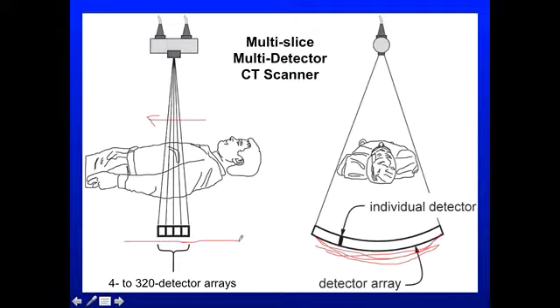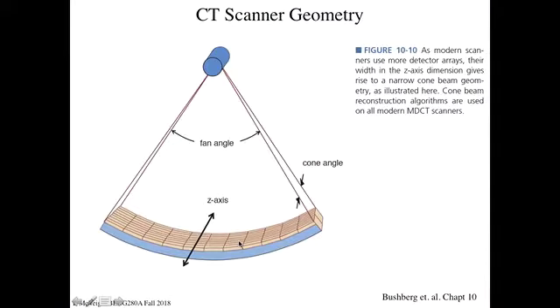You get the whole field of view, right? And you can now obtain those images, enough data, such that you get all of the 3D information you need in about 160 milliseconds for one volume. So this is what the geometry looks like now, with basically the detectors along the arc this way and in Z that way. When machines got to 64 slices, CT just took off in terms of usage because it became so fast to do a CT scan.